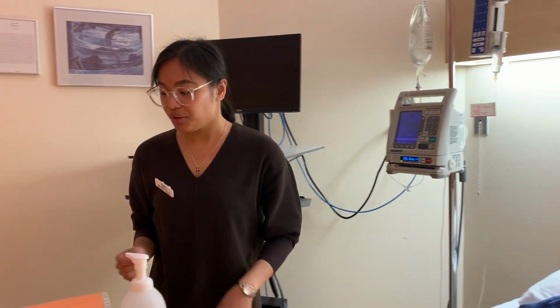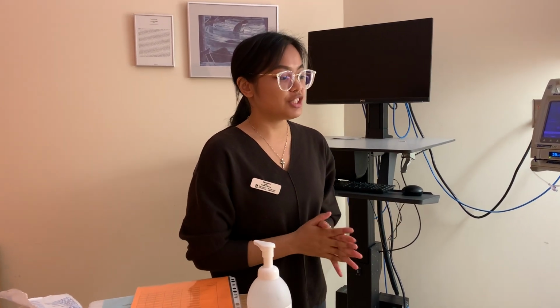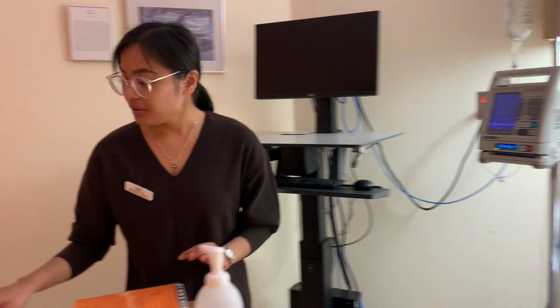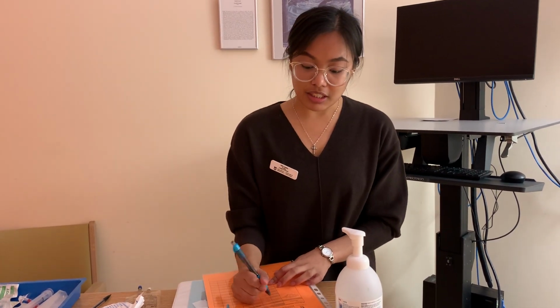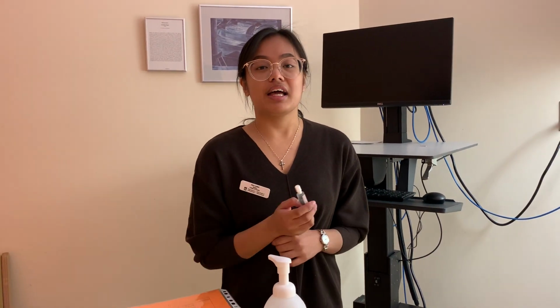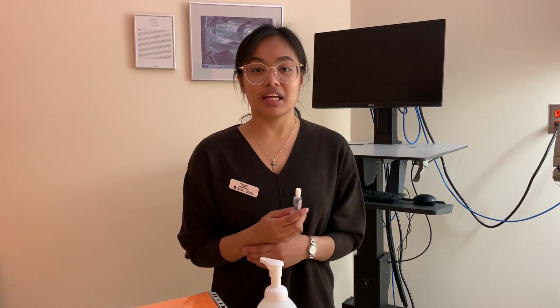So I've gotten that. Now I'm going to stay with the patient for a couple minutes, make sure that they've gotten their medication, it's infusing right, they're not experiencing any adverse reactions, assessing the IV site for pain, redness, or inflammation. And now that we've done that, I'm just going to document in my MAR that I've given it. So my name and designation with the time as well. And then I'm going to make sure to come back with a 3 ml normal saline for flushing. This ensures that the patient is getting the entire dosage of their medication as indicated by their MAR.